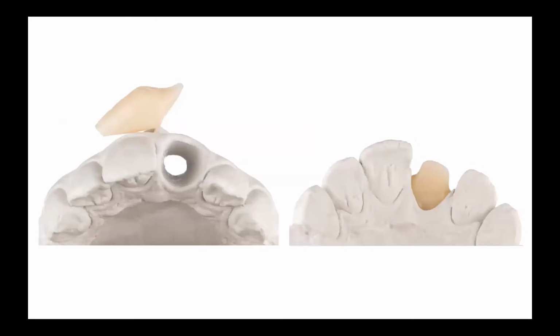We can make a Geller model, and after that duplicate our die with silicone and make the copy out of acrylic with the proper shade. This copy can be individualized with composite paints too.